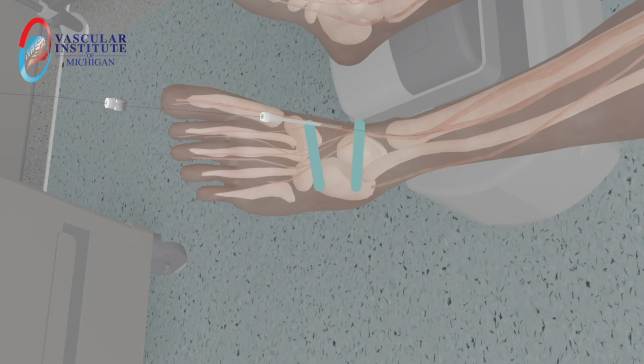The micro wire and dilator of the transitional sheath are replaced with a wire of larger diameter, which is advanced through the transitional sheath into the artery. The transitional sheath is replaced with a vascular sheath. The dilator of the vascular sheath is removed. The sheath is aspirated using heparinized saline solution.